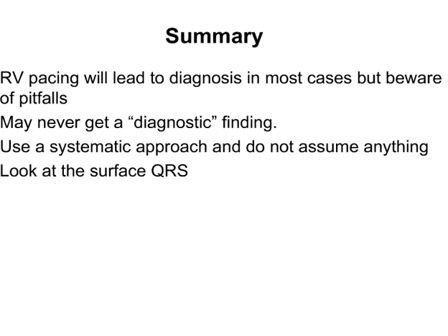Oh, okay. Yeah, so non-inducible is a tough one. There's some data that if you have very good evidence, a 12-lead ECG that looks like it's probably AV node reentry, and then you have evidence of a slow pathway with an echo beat, you can go ahead and try to get rid of that slow pathway even without inducible tachycardia. University of Michigan published a small series, and there was a larger series that confirmed that approach is good, if you have evidence that they may have AV node reentry.